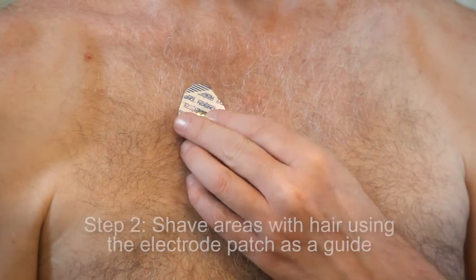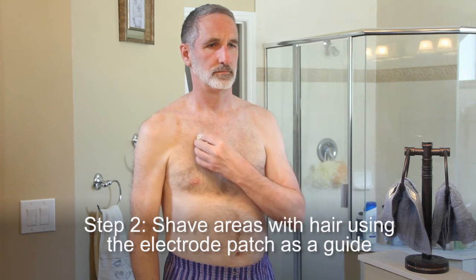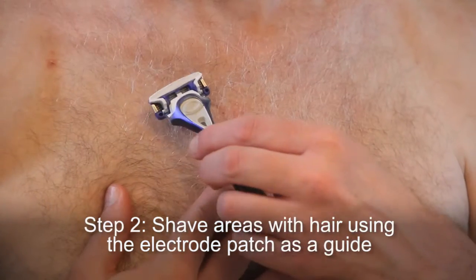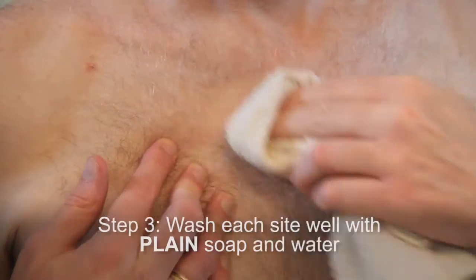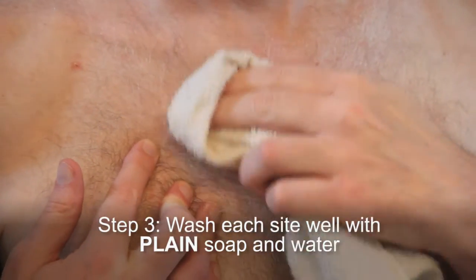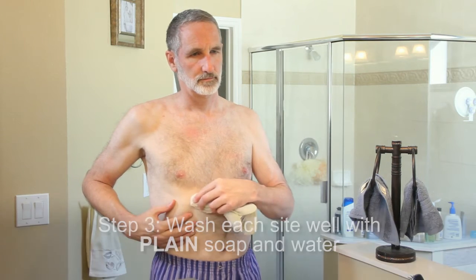Step 2: Shave areas with hair using the electrode patches as a guide for the size of area to shave. This ensures good contact and makes electrode removal easier. Step 3: Wash each site well with plain soap and water. You should not use soap that contains lotion or oil. Dry thoroughly.